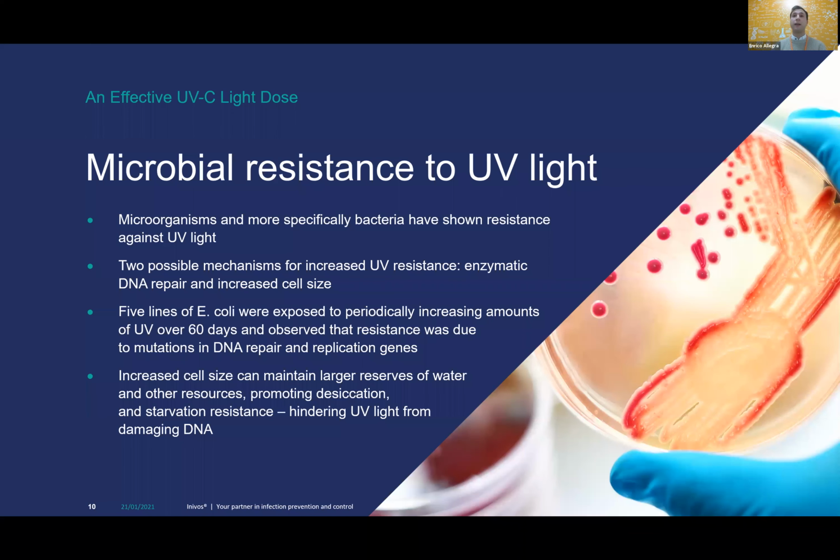I just wanted to touch on this to say how important it is to understand the right dose, because if we give the right dose to bacteria, we will be able to eliminate and eradicate the challenge. It's the same concept that we have with antibiotics in general, where you need to take the full course of antibiotics to fully eradicate your bacteria.